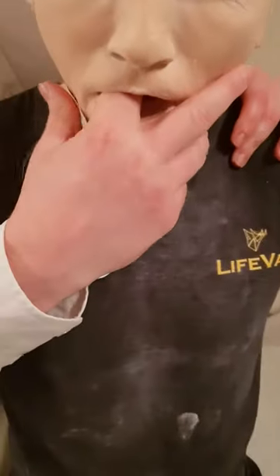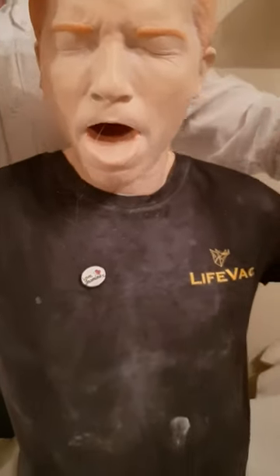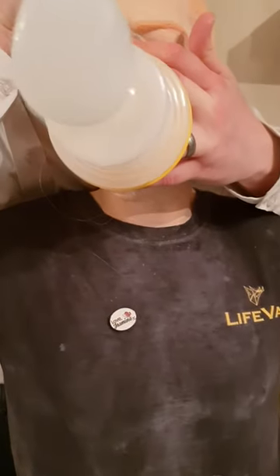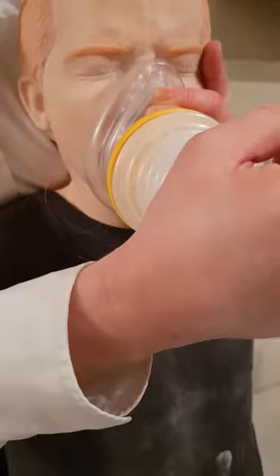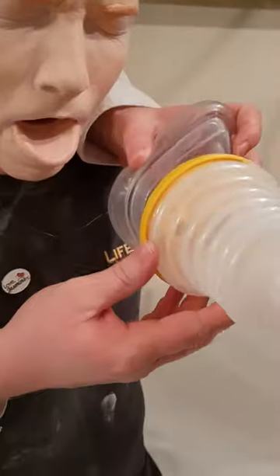Now, if Charlie is sitting in a chair or in a wheelchair choking, I've come behind him. I tilt his head back, rest it into my chest, place the LifeVac over the mouth and nose, holding it firmly in place, creating the seal. With my other hand, depress LifeVac and a quick pull. As you can see, this is why I went with the translucent bellows — because the bolus has gone into the bellows.